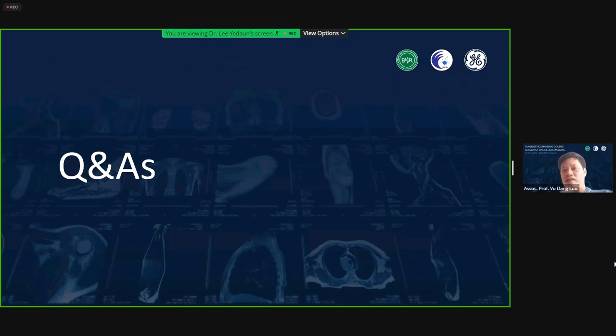And I have another question. You recommend a study about lower dose CT scanning for the diagnosis of HCC? Yeah, low dose. Low dose non-contrast, and after that for contrast, you use the standard dose.